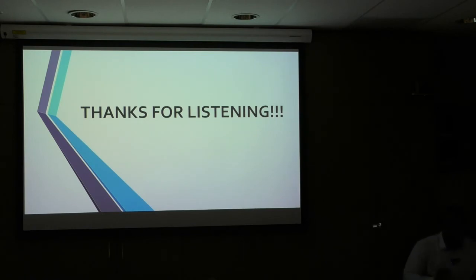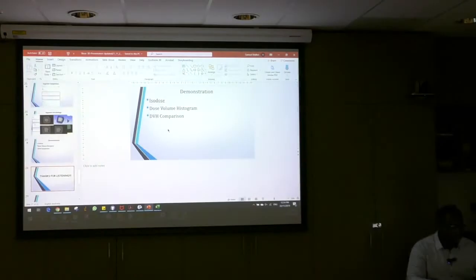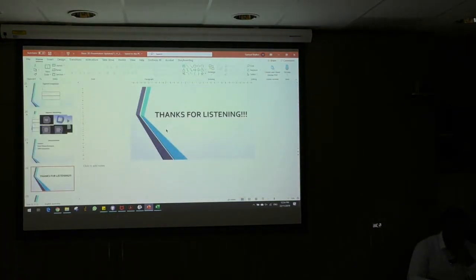I'm just curious, a stupid question: when did they publish Slicer, and when did we start actually using it, in B-block and so on? Because just a few years ago when I did my master's, I didn't know anybody who used Slicer, I didn't know it existed, and I just realized it's much more intuitive and user-friendly. We use Velocity most of the time to compare treatment plans, and this seems to be much better, and it's open source already. It's fantastic. So when did they introduce it, and when did we start using it?